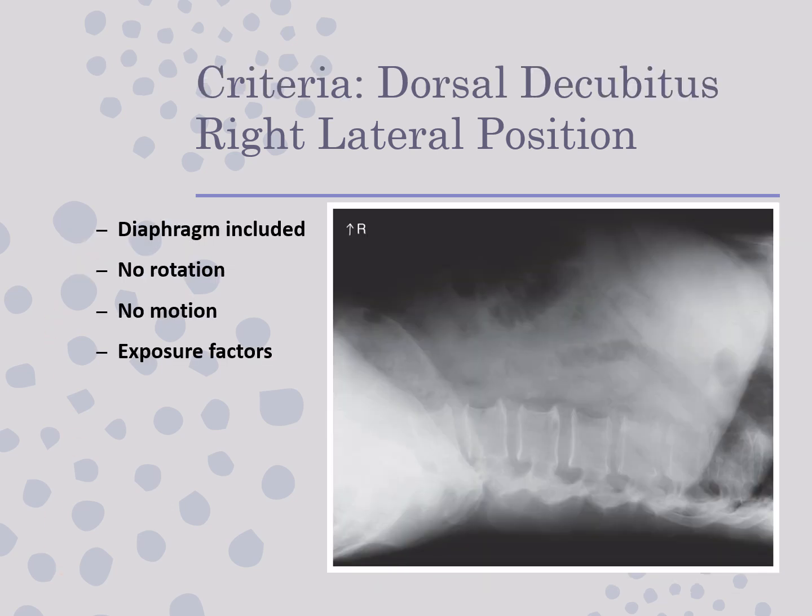This is actually a good picture of the dorsal decube. You can see the lumbar spine right here. This is the back side of the patient. This would be their sacrum right here. And then this is their abdomen. So a lot of times they're looking for aortic aneurysms in the prevertebral area, or in front of the vertebrae.